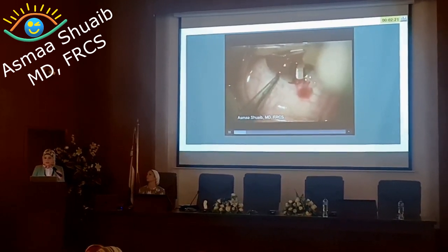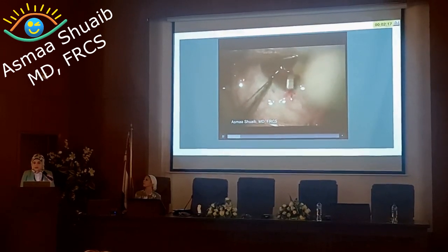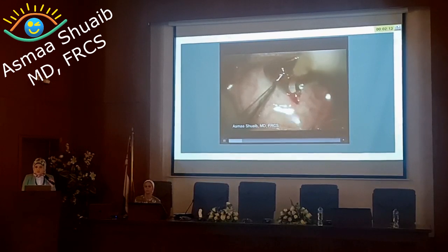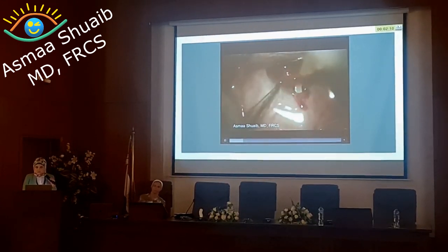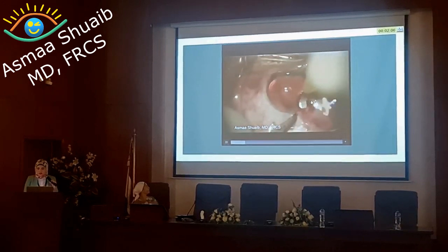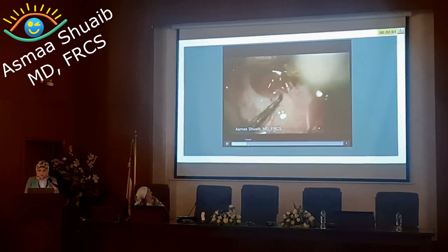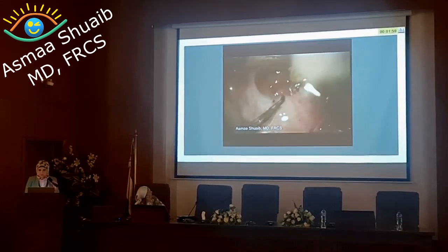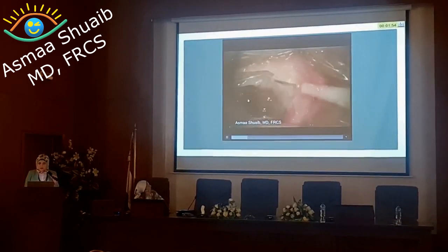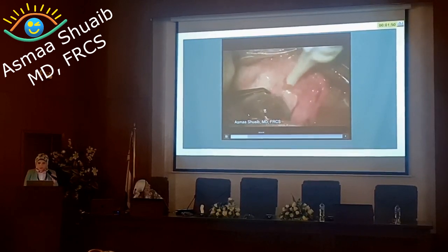Go with the crescent blade through clear cornea and then make your tunnels in the sclera by doing a partial thickness wound. This is the way a Hoffman pocket is done. And the other pocket is fashioned directly opposite to the first pocket.